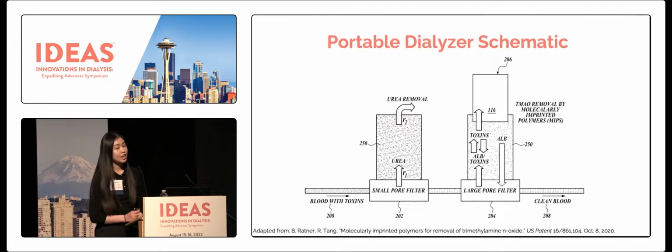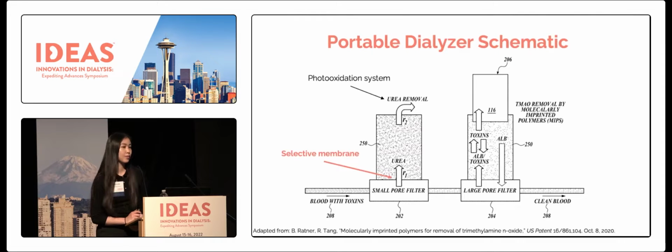On this slide is a portable dialyzer schematic. The urea removal step would be accomplished with the photo-oxidation system. And below that would be the selective membrane that we successfully engineered in this project.